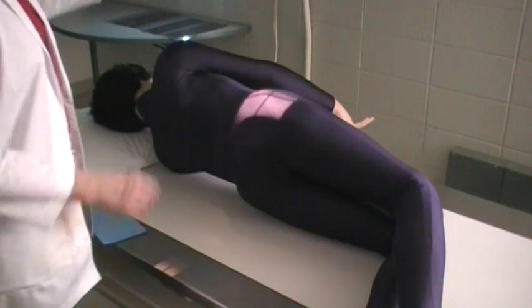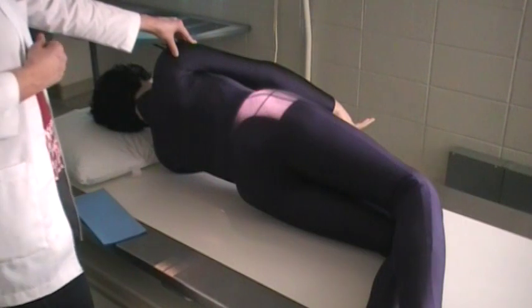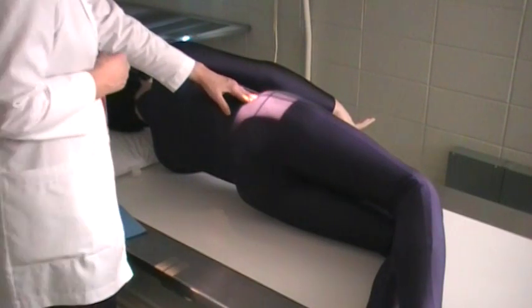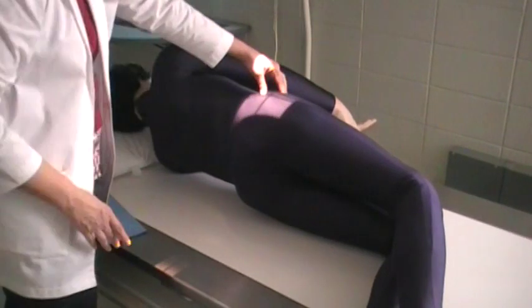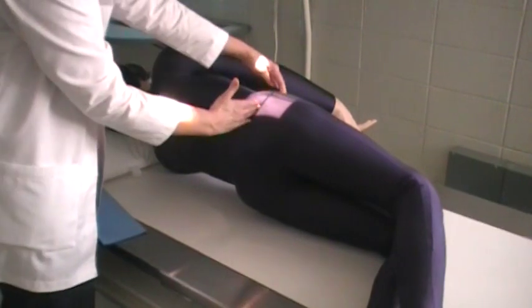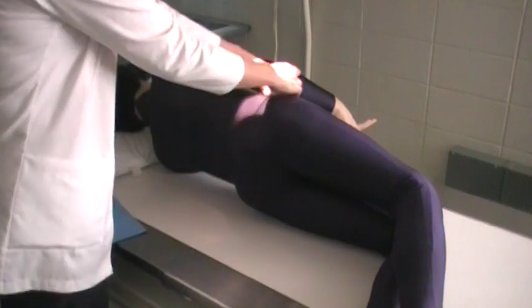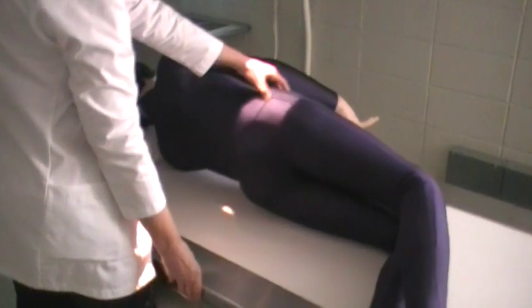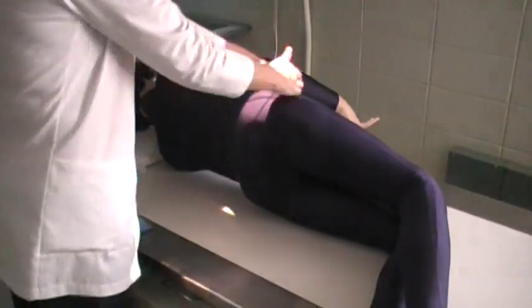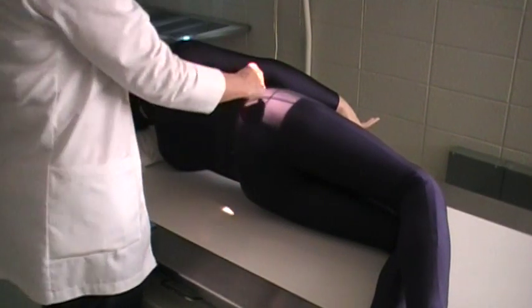Once the patient is on their left side, nice and straight, you're going to palpate for the crest and then come anterior until you feel the ASIS — this is where the transverse line is going to cross. Then bring your longitudinal line to be at 3½ inches posterior to this ASIS. So, 3½ inches behind or posterior to the ASIS is where our longitudinal line is.